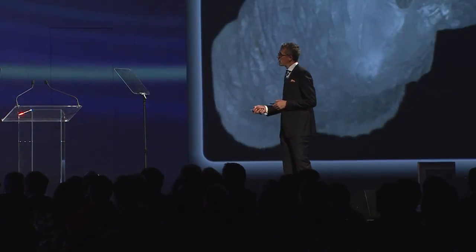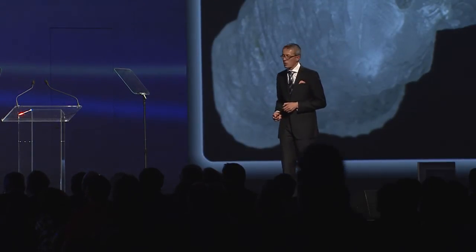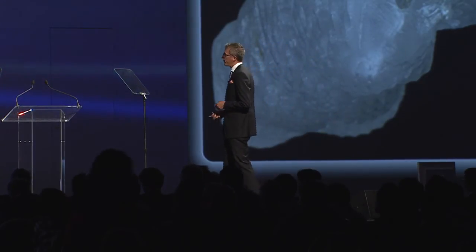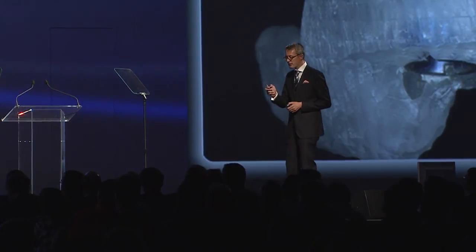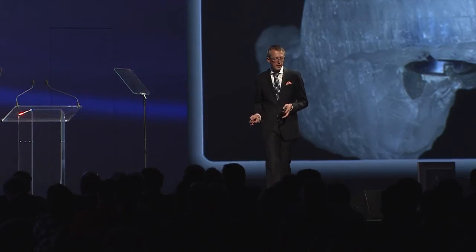Then I had the chance to do the implant surgery completely guided with the Navigator and this OptiGuide surgical guide based on the CEREC scan using the OmniCam. The implant can be placed through this sleeve, and this is the final result after placing these 2 implants completely guided.